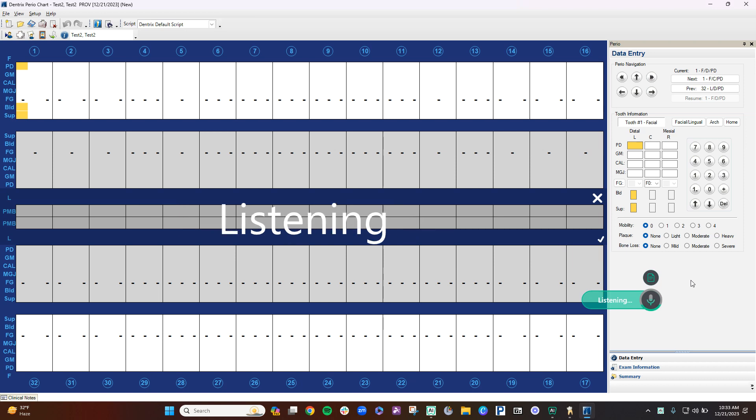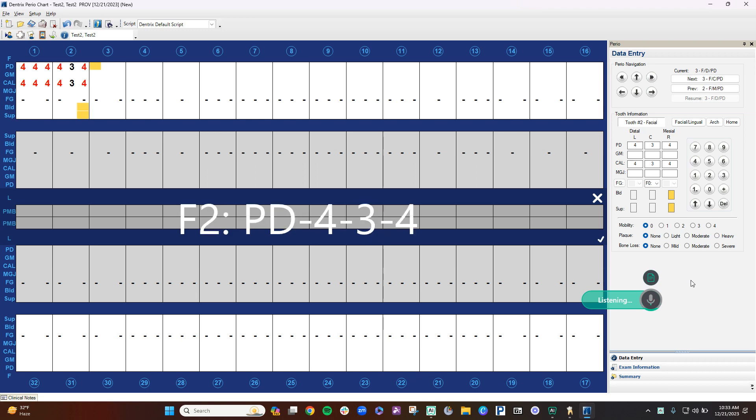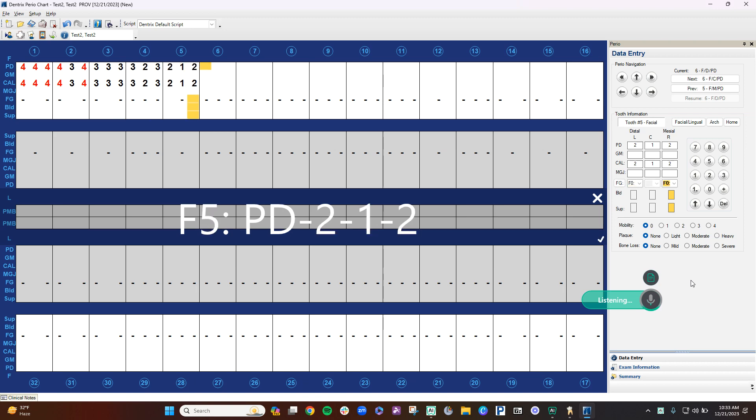4-4-4, 4-3-4, 3-3-3, 3-2-3, 2-1-2, 1-1-1, 1-2-1, 2-2-2, repeat 5.